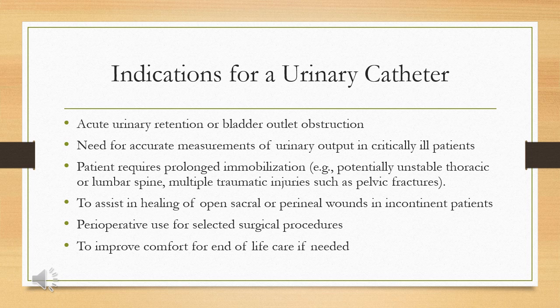Patients that require prolonged immobilization, so those patients would be your multi-trauma injury patients, such as ones that have pelvic fractures, patients who are quadriplegic, and patients that have maybe a spine injury. Another reason would be to assist in healing an open sacral wound or perineal wound. So having a catheter placed prevents the urine from getting in those wounds and causing further infection.